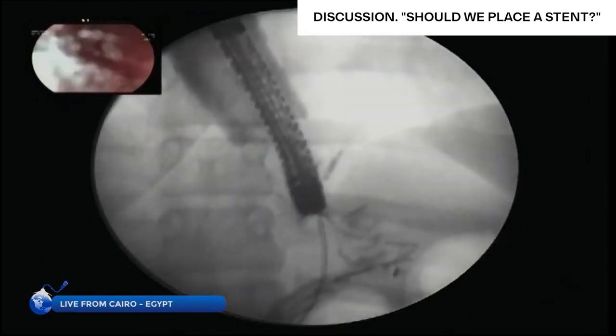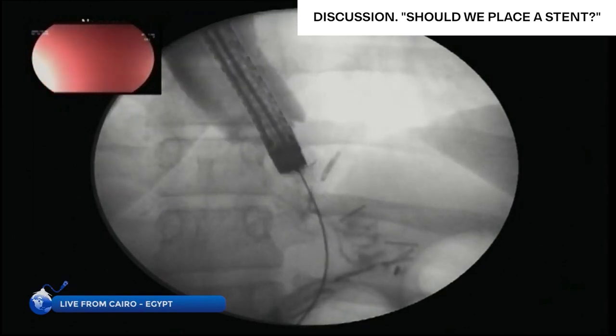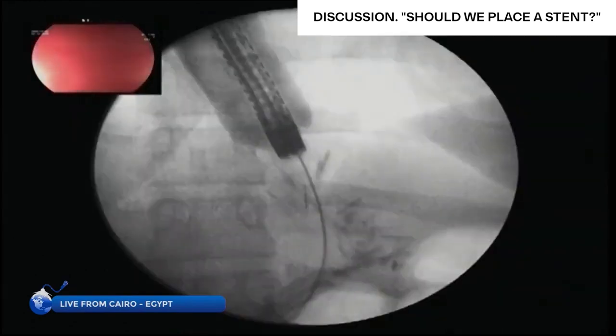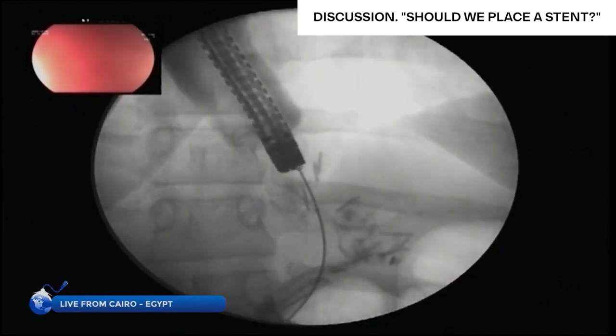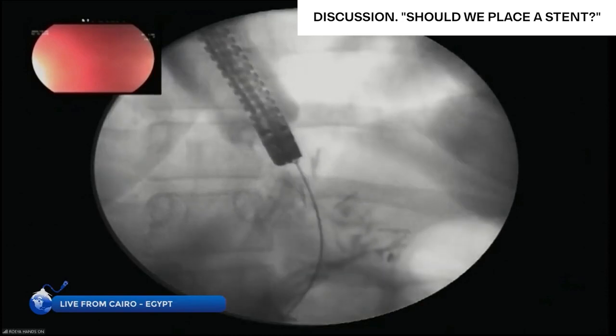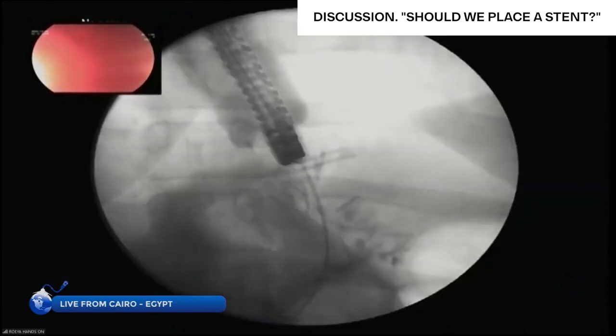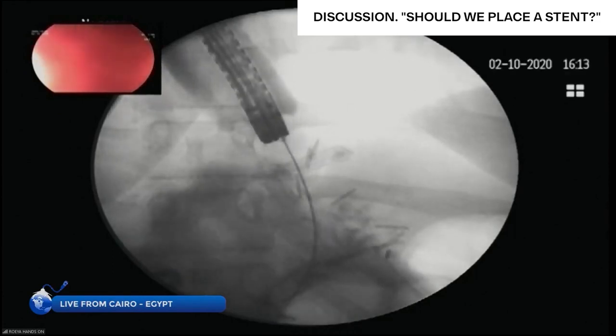Yes. I'll put my mark here at the first, this is where we have seen this small protrusion. To make it a little bit lateral. On screen on. Yes. Perfect. So this is where I will put. I should cover this very small abscess.